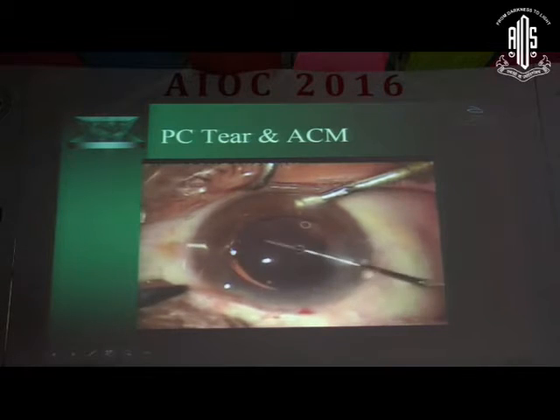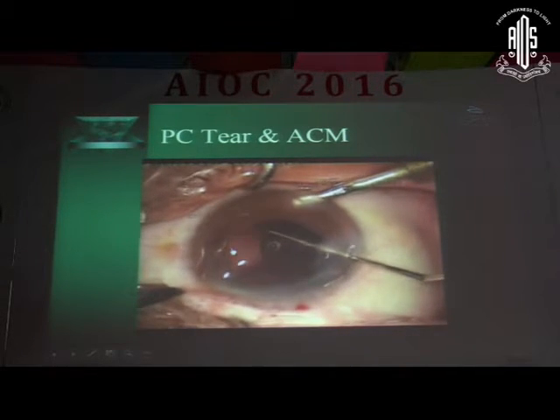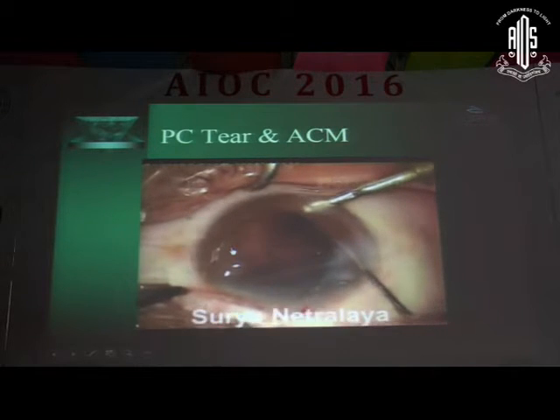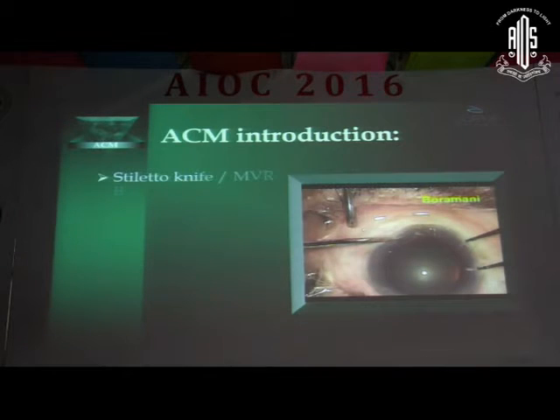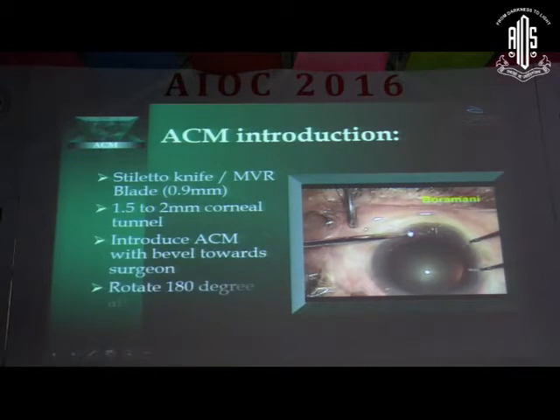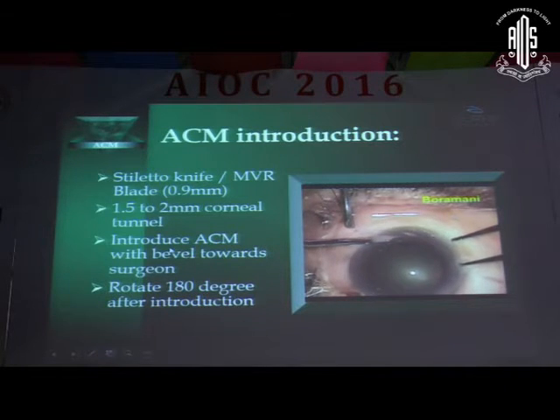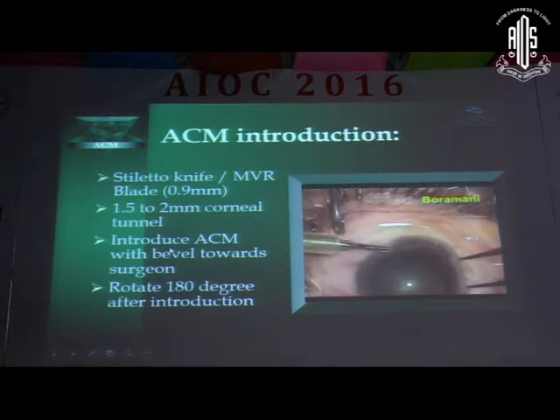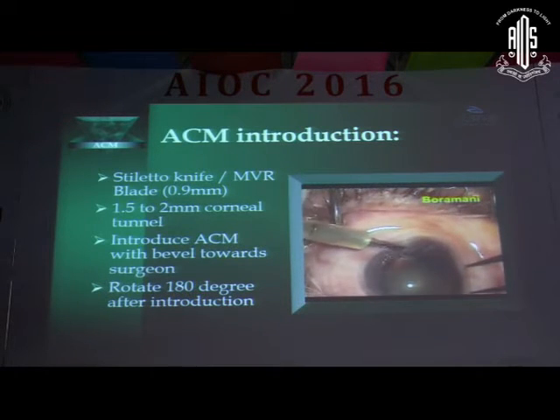Only if we put a large instrument into the main channel, there is a sudden gush of fluid outside and the vitreous can get more disturbed. So all these maneuvers should be very gentle. The anterior chamber maintainer is introduced generally at the lower limbus through a tangential tunnel. This is not a radial tunnel like a side port. You make a small tangential tunnel, about 2 mm, with an MVR blade and the anterior chamber maintainer is gently introduced and kept on throughout the procedure.